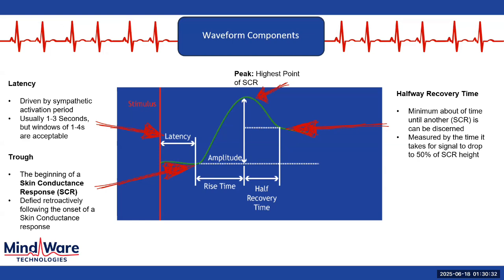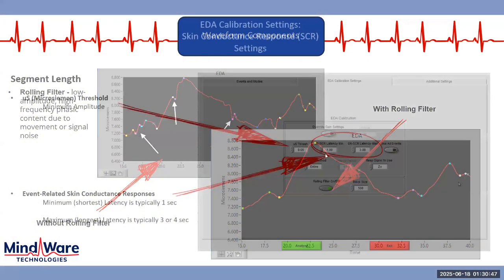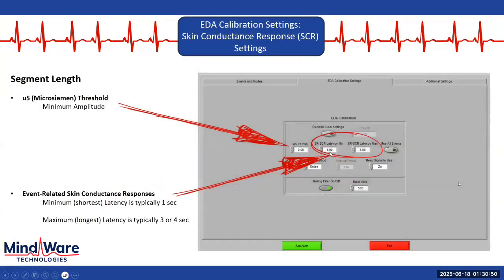And then we can say that if there was something that we thought would evoke a physiological reaction, then we could look for that latency and then say, again, this SCR was due to that. So in those cases, those are event-related SCRs, and this is setting that window. If you remember, I said at time zero, the actual event occurs. There's a natural latency within our physiology before that sweat can actually be pumped out of that pore. It's a very slow measure. And so we would actually say that any SCRs that occur about 1 to 3 seconds afterwards are going to be event related, or ER-SCRs.